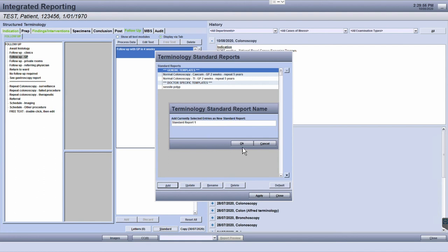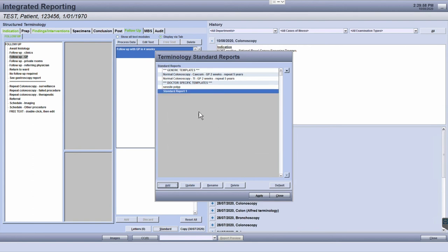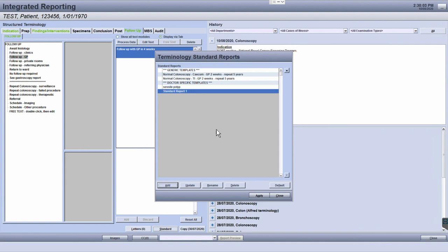You can also update, rename, or delete existing standard report templates by clicking the relevant buttons.